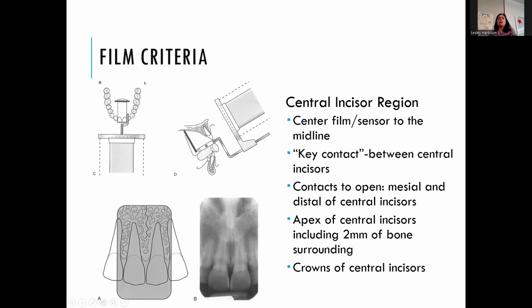Sometimes we'll do that if people have trouble biting or if they're missing a tooth. There are different reasons that someone might use a cotton roll. This should be roughly what is captured on the film. We should see in between 8 and 9, and then we should see the contacts between the laterals and the centrals. Now, this is a beautiful one, and all the contacts are roughly open, but that doesn't always happen. Sometimes people have overlap in their laterals, and you can see it obviously between their central incisors, but between their laterals and centrals you might get a little overlap.